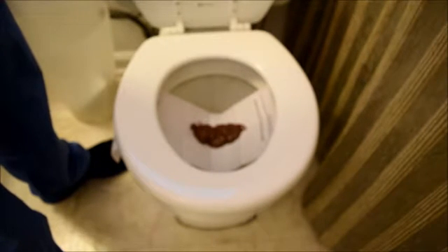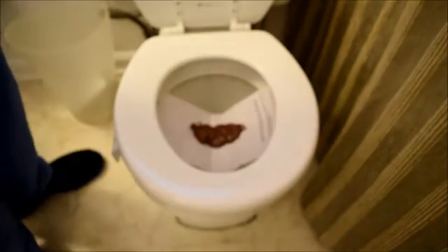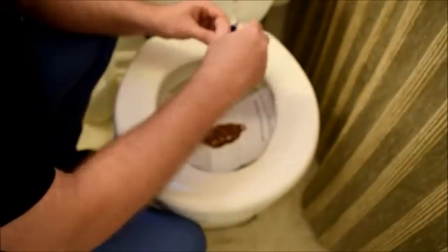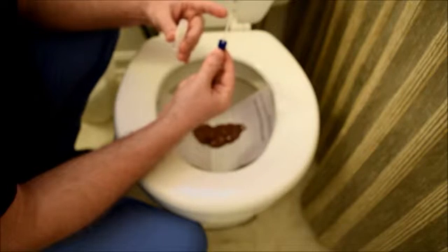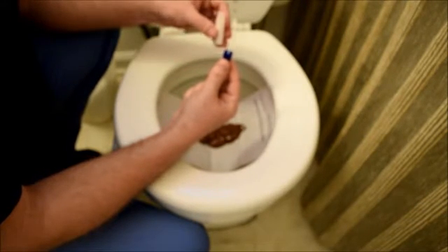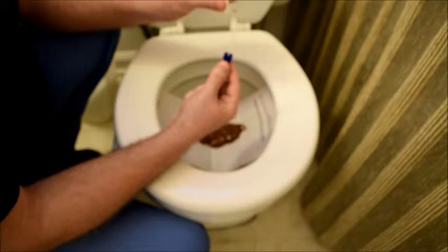Now that you have your sample on the tissue paper, it's time to actually use the collection tube to collect your sample. Unscrew the colored cap on your collection tube and take out the probe. There are ridges on the end of the probe. All you need is enough sample to cover the ridges on the end of the probe. Please do not fill the collection tube once again.